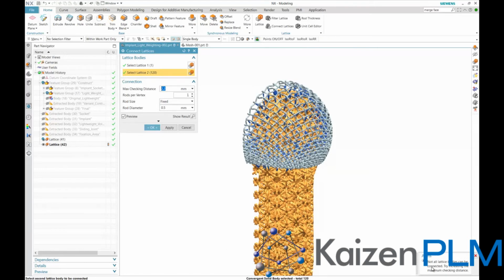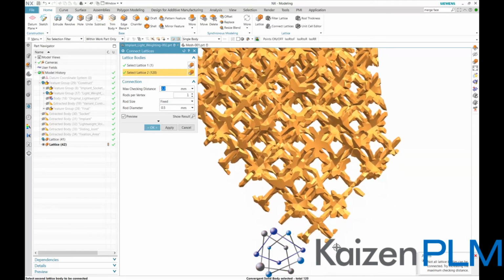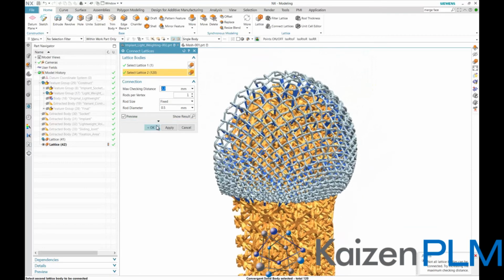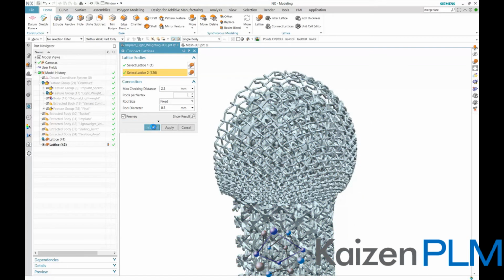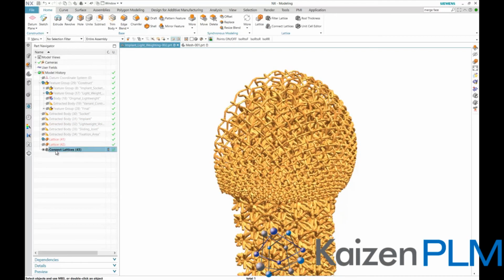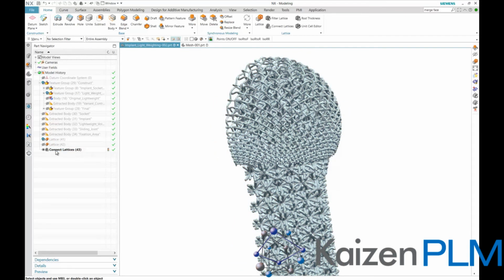We also note that we receive a warning that not all bodies can be connected. That is due to the dangling bits we chose to keep earlier. Note that the resulting connected lattices feature also produces its own resulting body, just like filter lattice earlier.